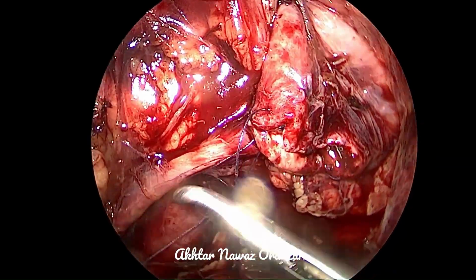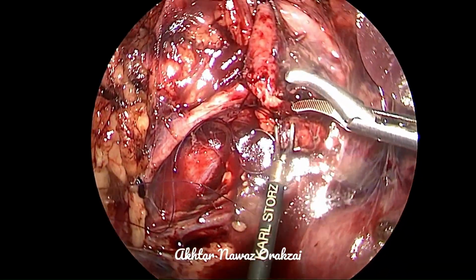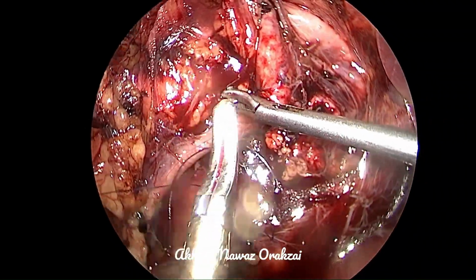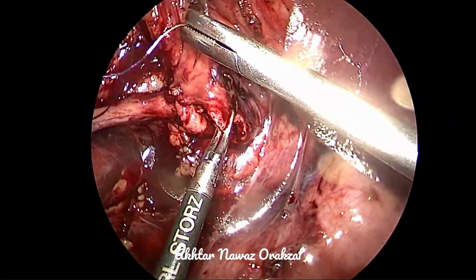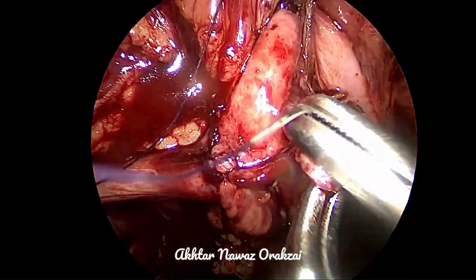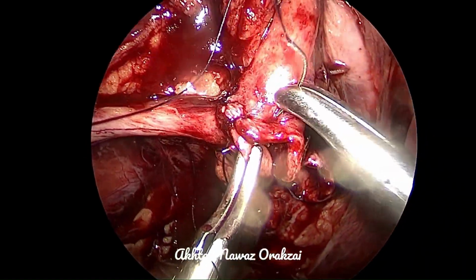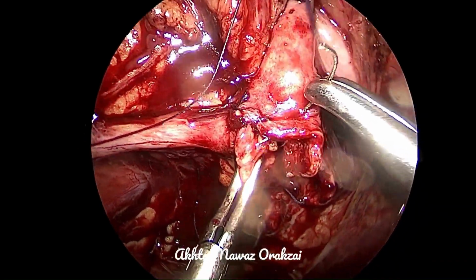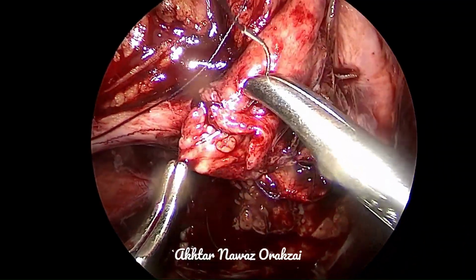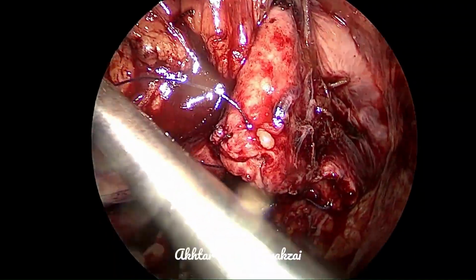You can see the ureter very clearly, and you can also see that the periureteric tissue is preserved, and there are longitudinal vessels running in the periureteral sheath. In cases where adult pyeloplasty is performed, it has been noted that 30 to 40% of the cases have crossing vessels.